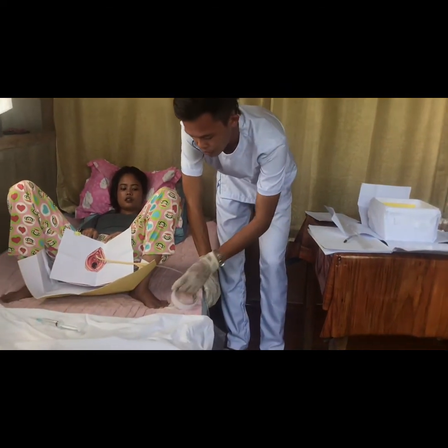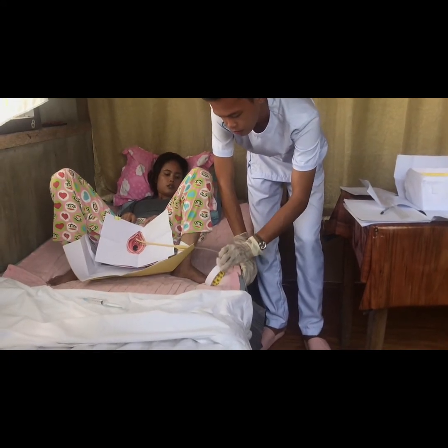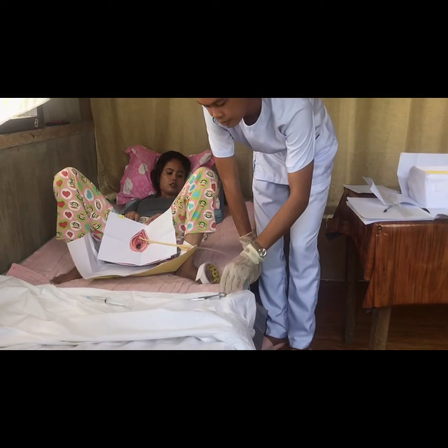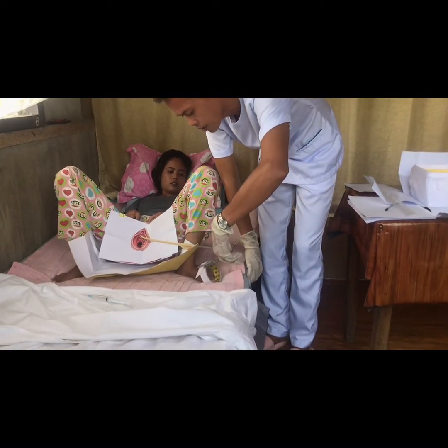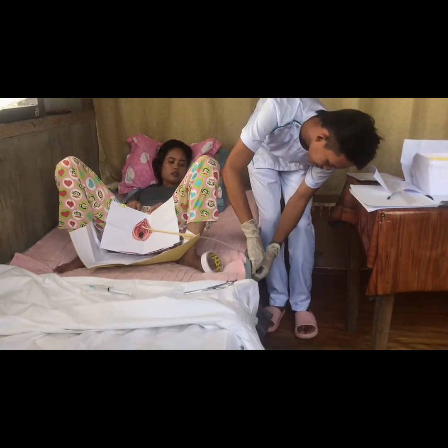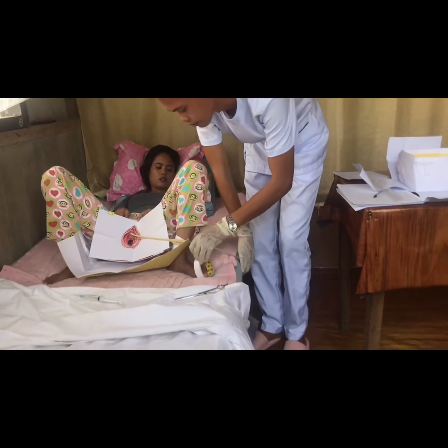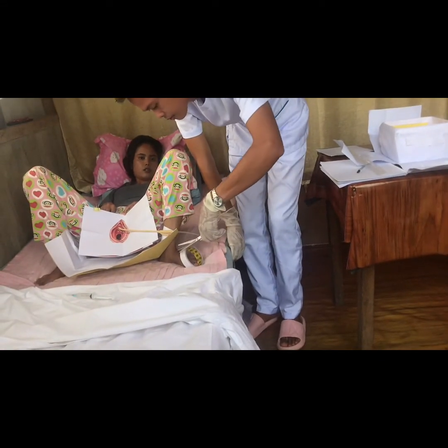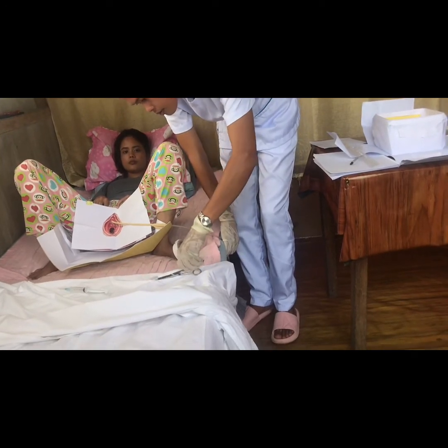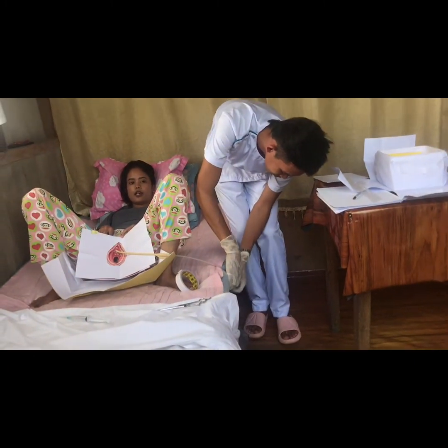And I'm going to use this one in order to paste it, in order to prevent it from moving. Going to use scissors to cut it, and then we're going to place the urine bag here. Hold on, ma'am, we're already done. Okay.